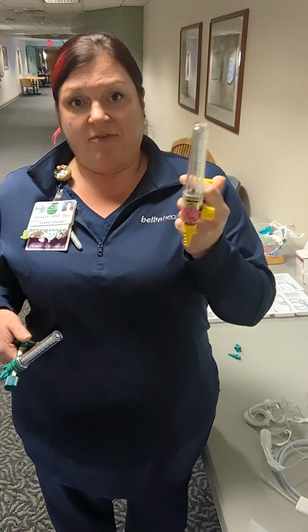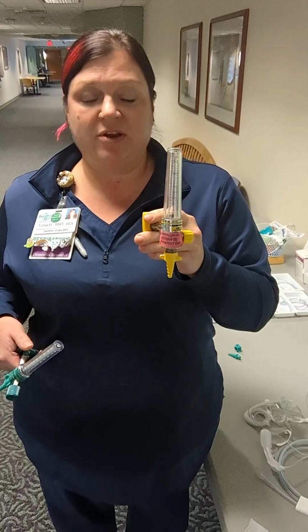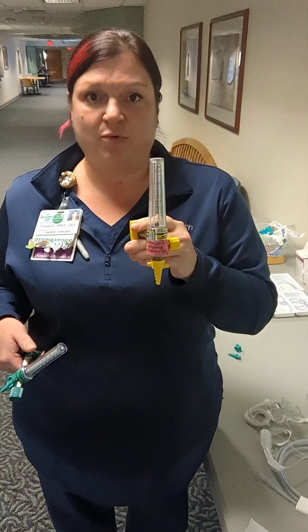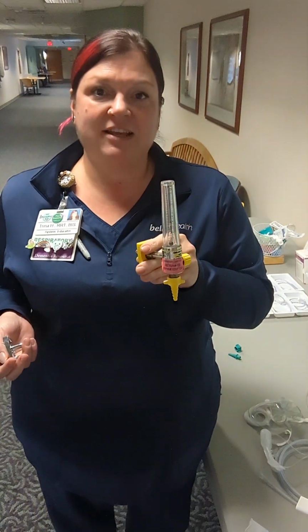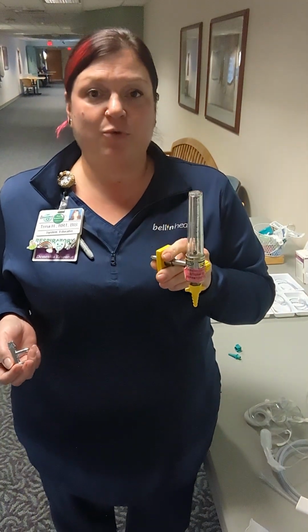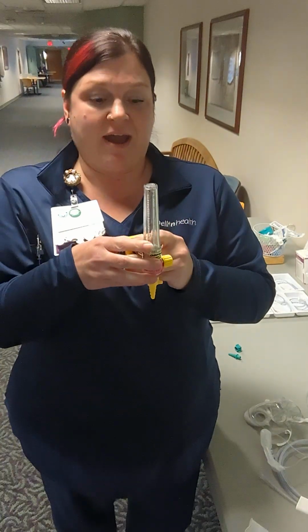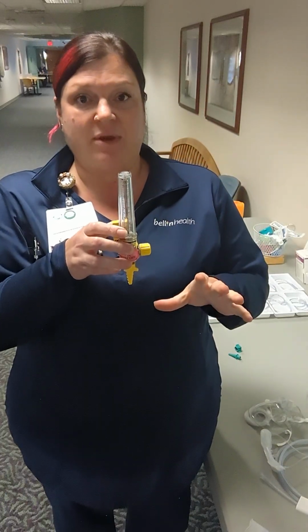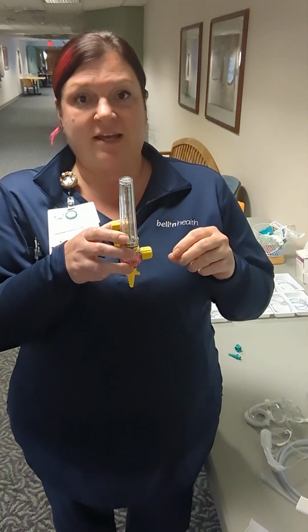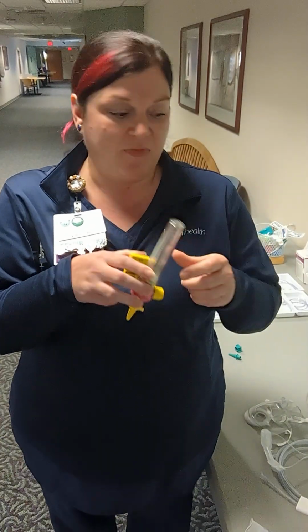When we have room air, so this is a flow meter for compressed gas called room air, which we're breathing right now, the oxygen content, or FiO2, of room air is 21%. No matter how high I turn this flow, no matter how fast this gas is coming out, the O2 content is always going to be 21% oxygen.